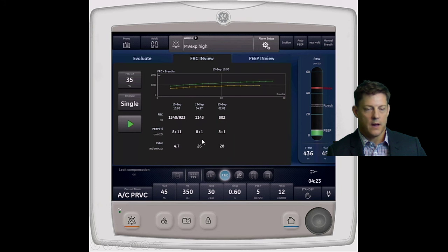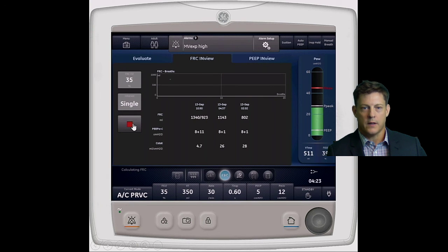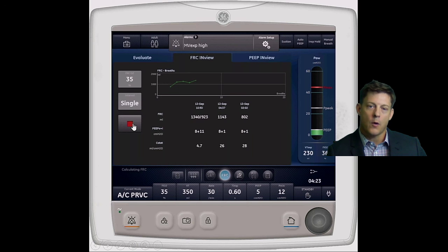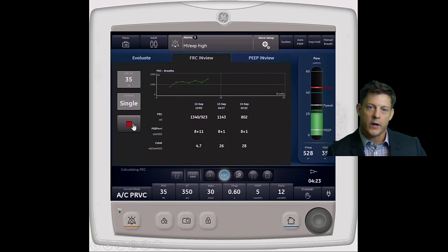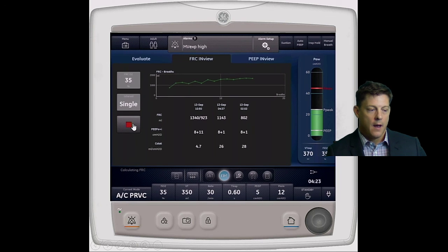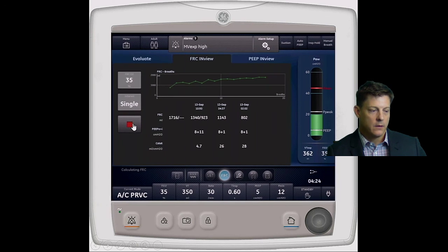So this shows an image of previous procedures. If I hit the play button, it's going to start doing a procedure. Now I found one glitch, but I didn't want to go back and rebuild it and re-hyperlink it. I just wanted to release it. This was a long, lengthy project, so I just wanted to release it. So I'll kind of point out the glitch.